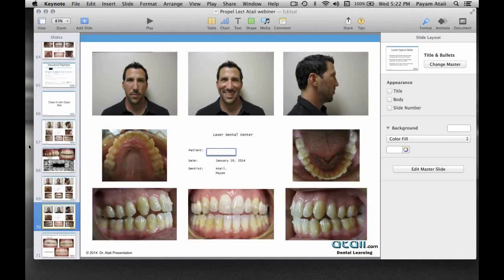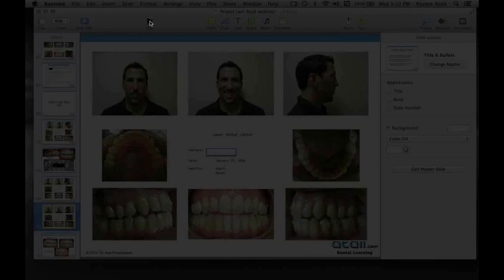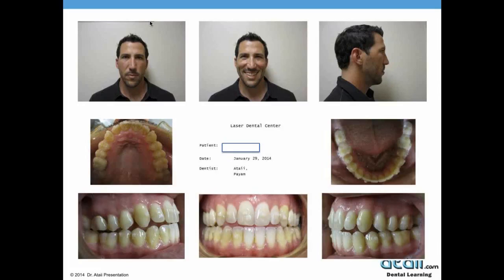Okay? So in deciding how many Propels you need, if you have 30 aligners on a patient and you're giving them 10 to 12 weeks of movements and they're changing every week, you're going to need additional Propel. But if your aligners come back as 10 or 12 aligners, then you probably need only one device. That's another way to calibrate if you're an Invisalign doctor with access to the ClinCheck.